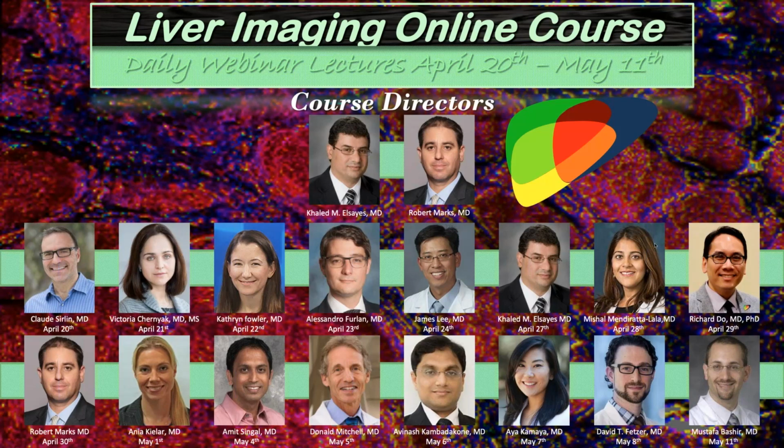And so my feeling is when I see a lesion that changes imaging features, even if it changes in a way that might make the lesion look less worrisome, that does not reassure me. I often get very worried about lesions that are changing their appearance, even if they're not changing in size, even when the change in appearance is one that you might think would make the lesion look more benign rather than more malignant. I'm curious, Don, what has been your experience with that phenomenon, and also what others that are listening in might think about that.